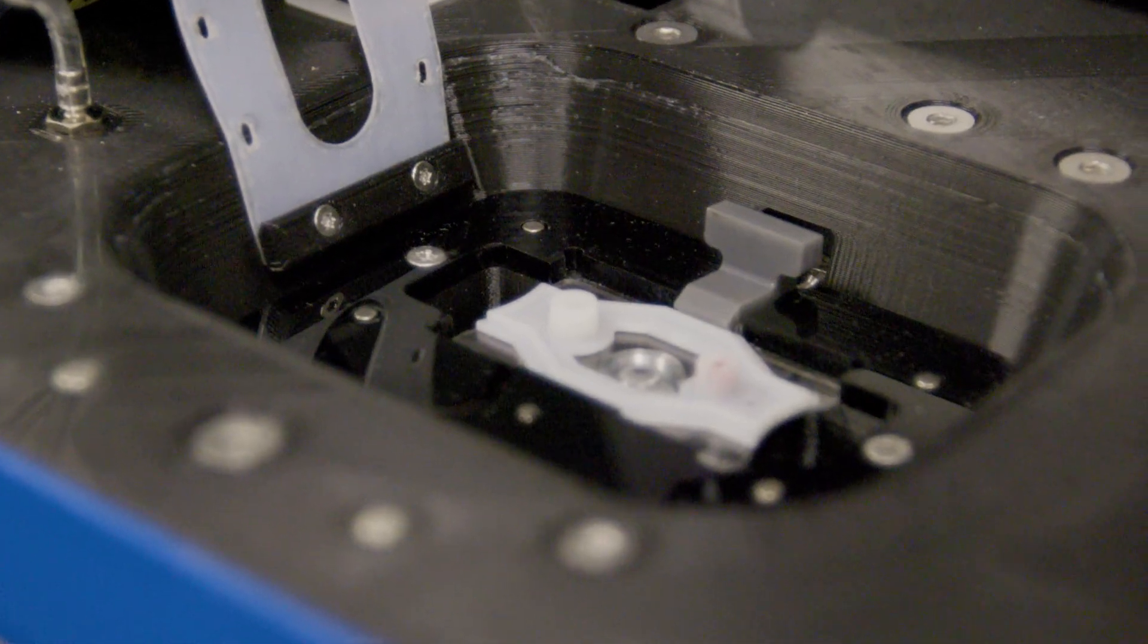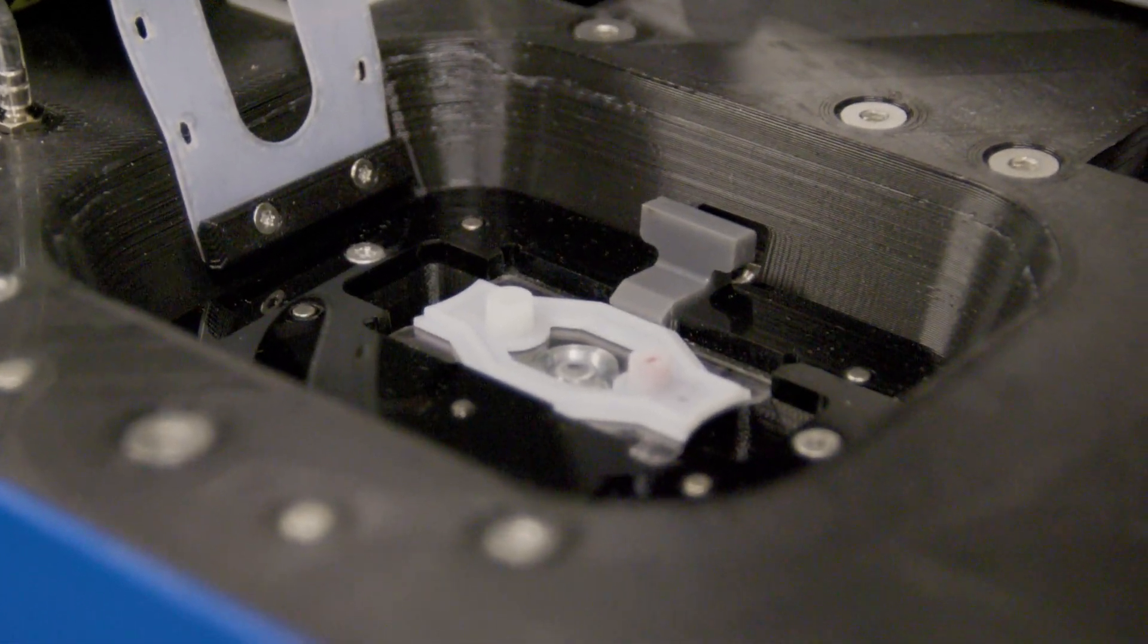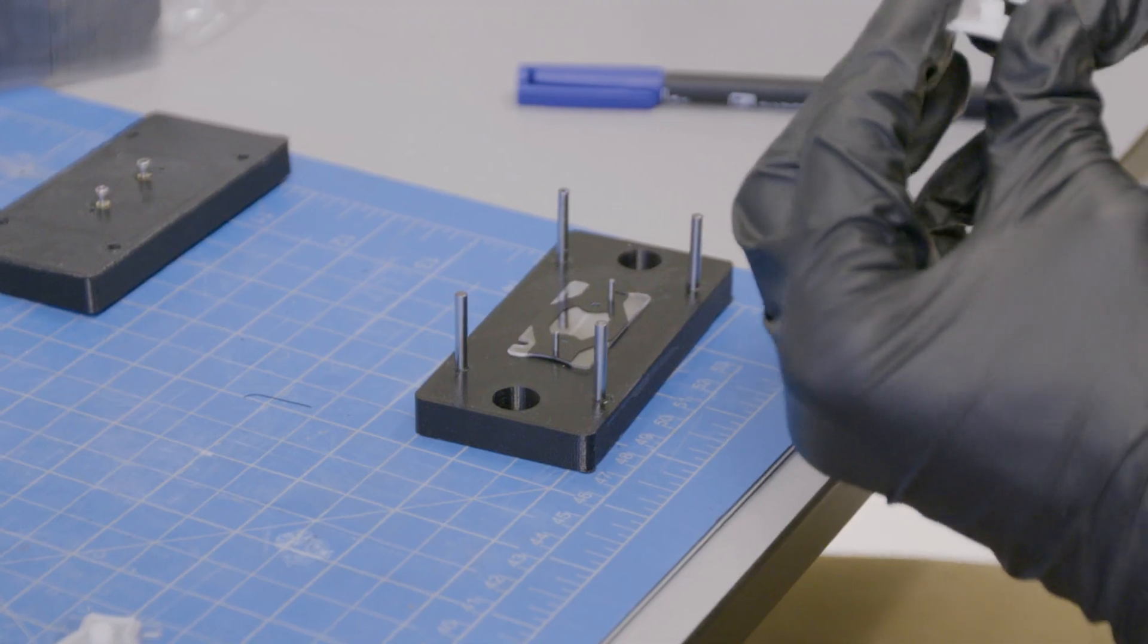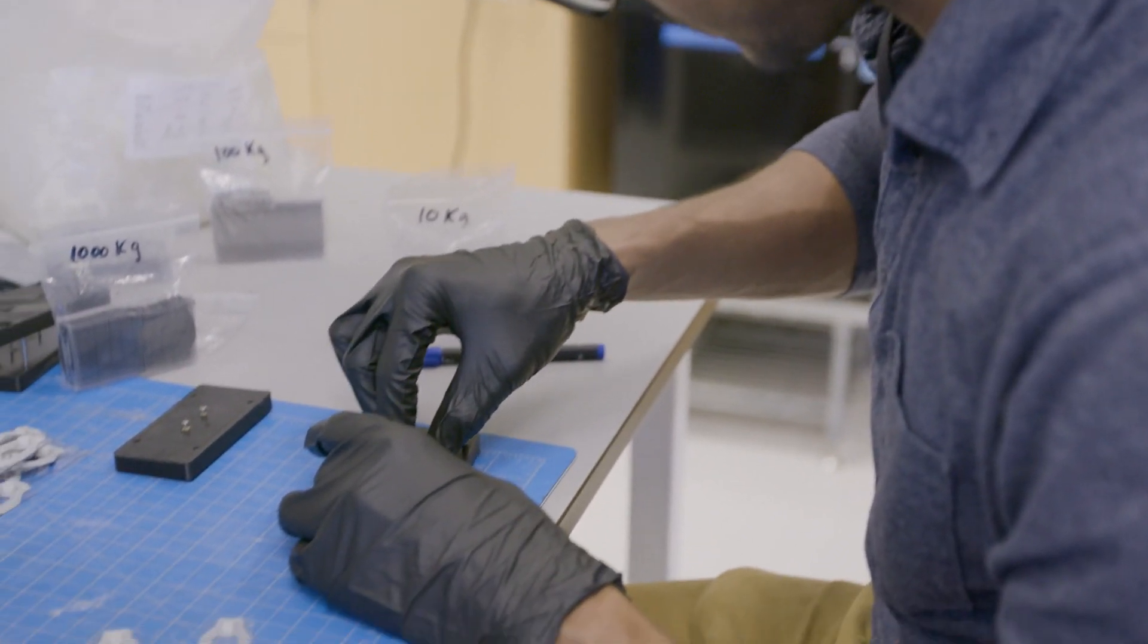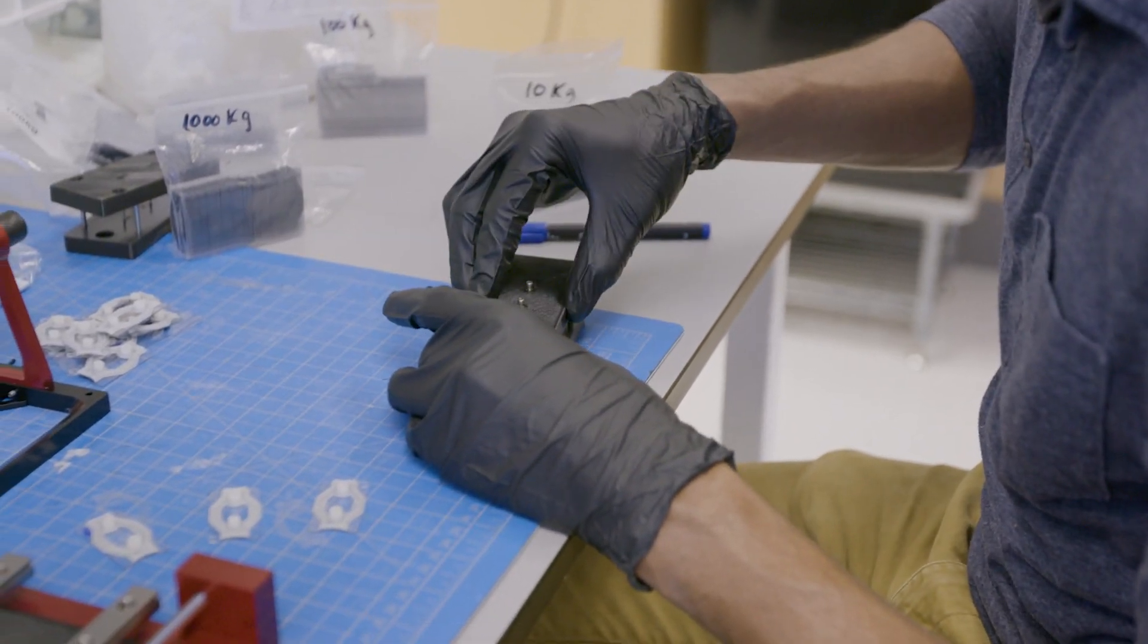Then the challenge becomes how to make the flow cell, which is the disposable cartridge that the machine consumes for every test, as cheap as possible. I pushed the team to figure out a way to do that here in-house. Then we knew we had a path to do something low-cost.